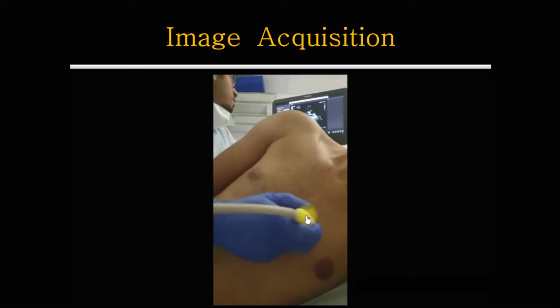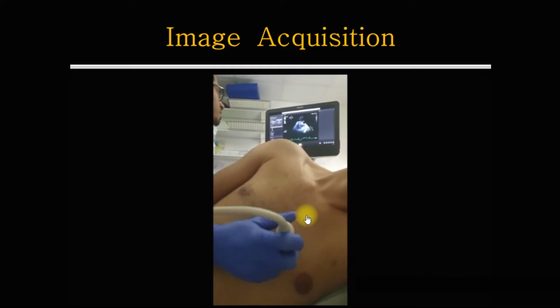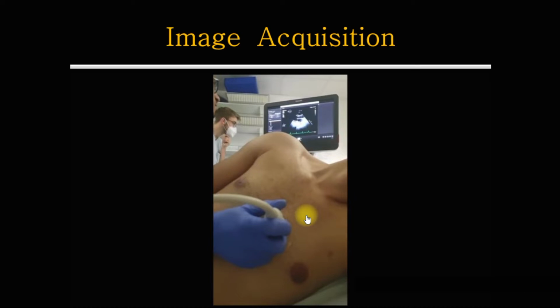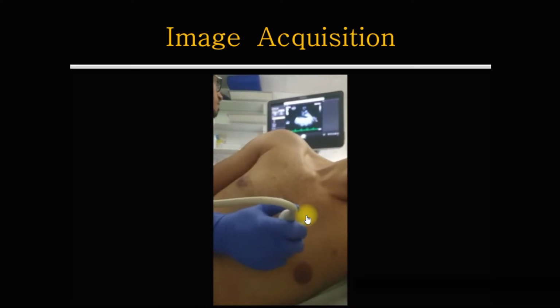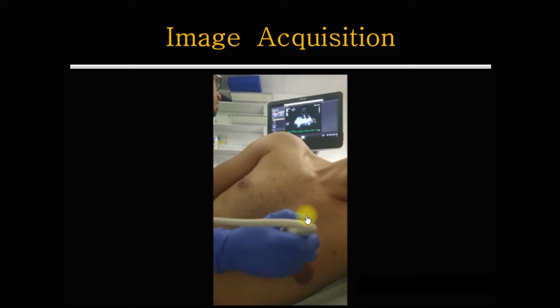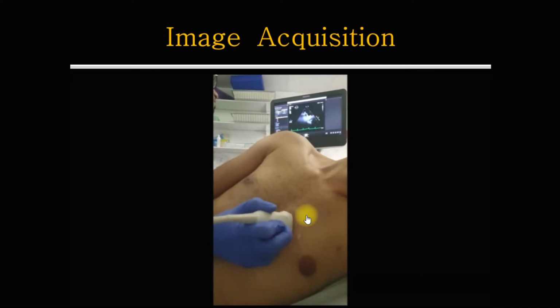At first is the parasternal long axis view, probe pointing toward 9 to 11 o'clock, tilt up, right ventricular inflow, then tilt down, right ventricular outflow.